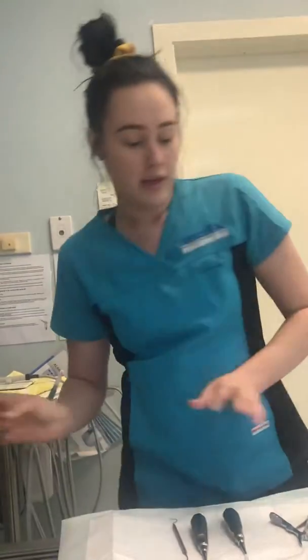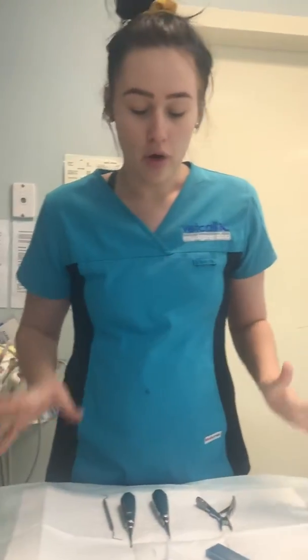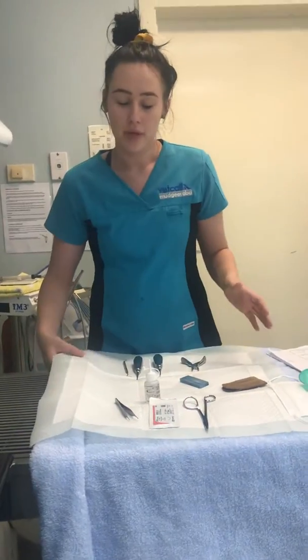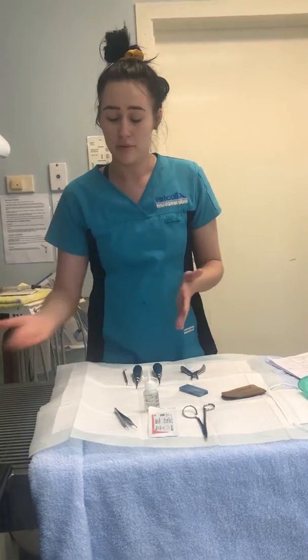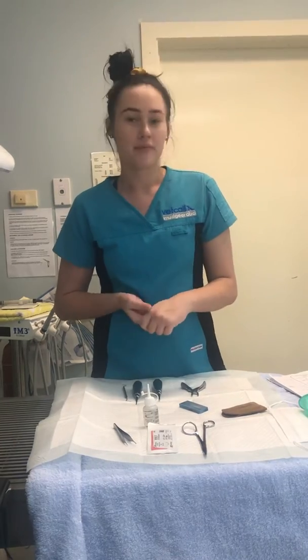So now that everything is all set up, we're pretty much ready for our dental extraction. And just to make a note too, because we are doing a dental procedure, having adequate heating underneath a certain amount of towels, just because it is a wet procedure, the patient's more likely to get a bit more hypothermic.